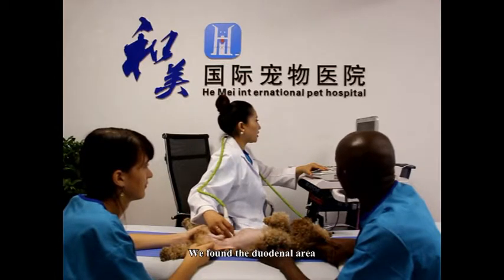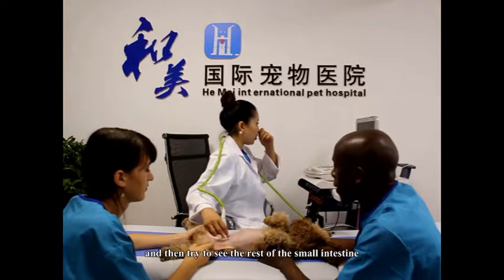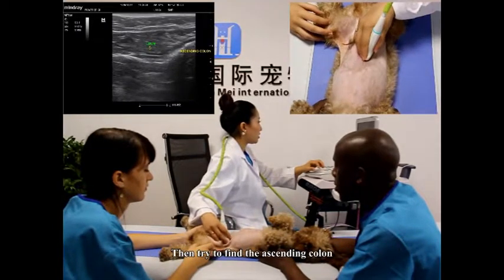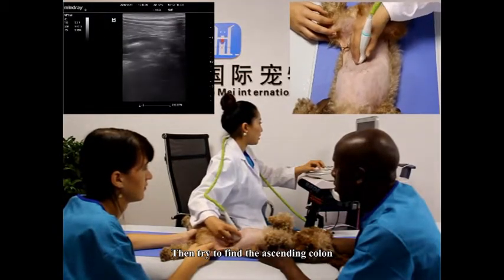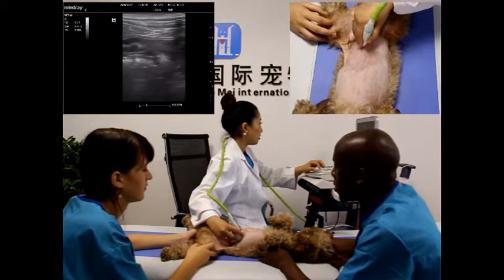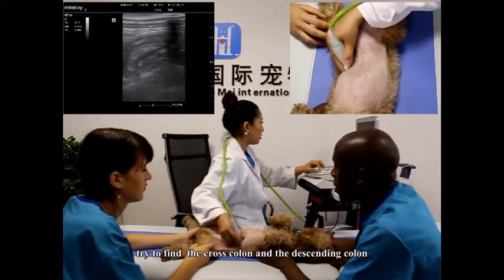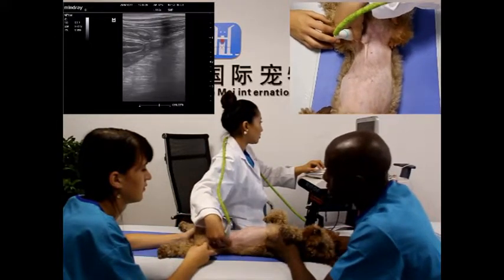And once we found the duodenal area, we follow it to see the rest of the small intestine, and then we try to find the ascending colon, the transverse colon, and the descending colon.